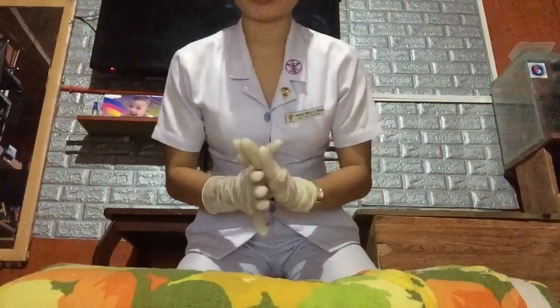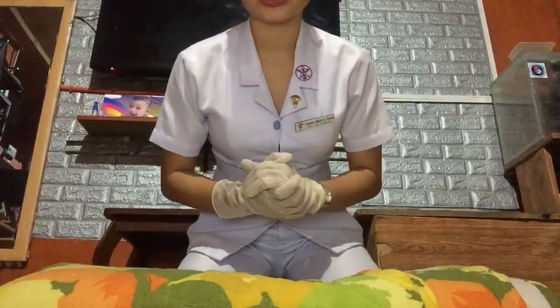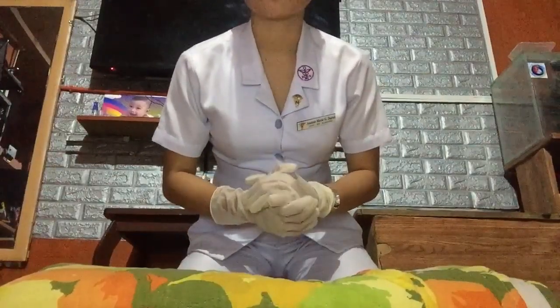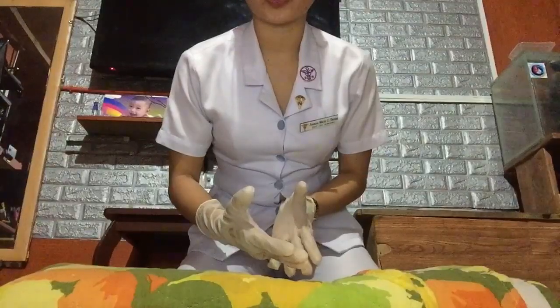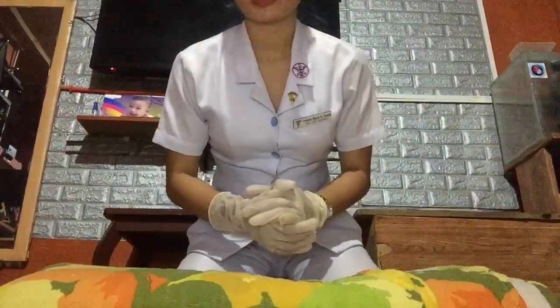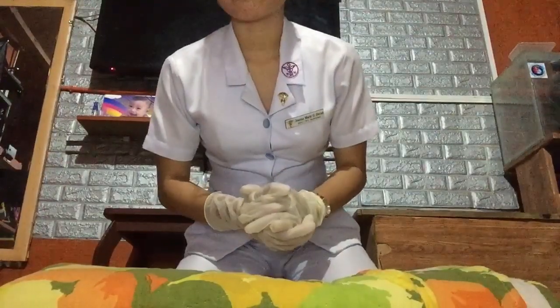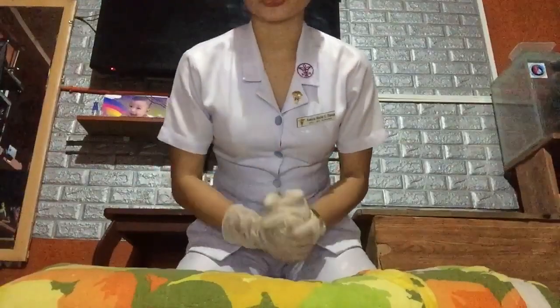Now, assuming that I am the second responder, turn on the AED. Quickly scan the patient's chest. If the patient's chest is hairy, you will have to quickly trim the areas where the pads of the AED will go, because hair will act as a barrier, and the AED might not be able to deliver the shock.